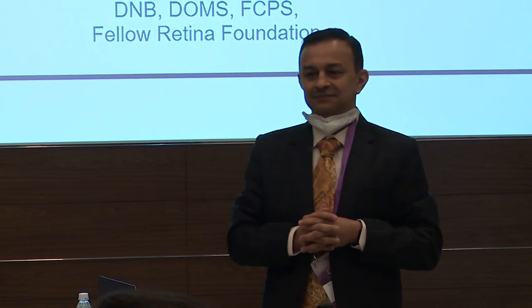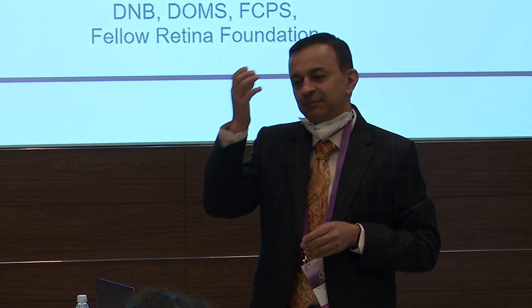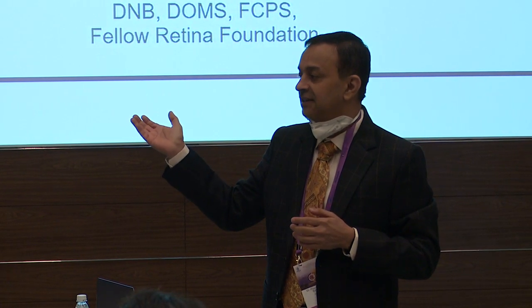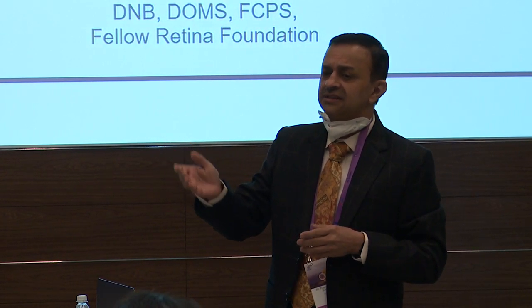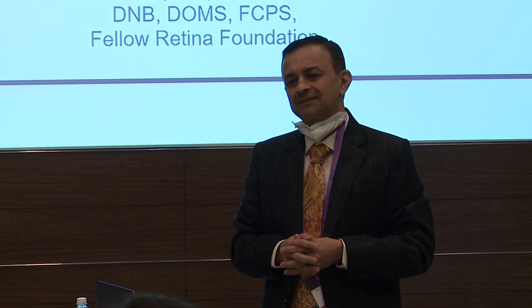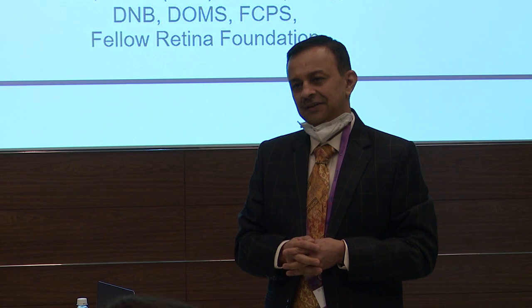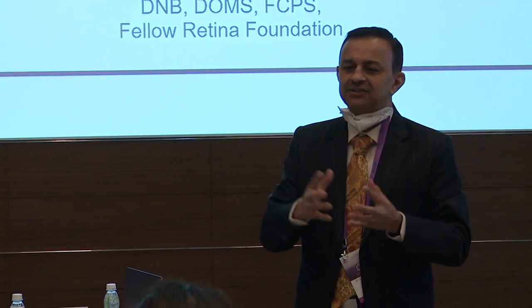Angiography is a dynamic process, right? It shows the leak. OCT will not show the leak, but you can really pick up beautiful images, like Nitin sir shared a few of his photographs. Many of these lesions show neovascularization even on OCT angio, but whether they are really active or not, you will know only by FFA. You can make out from the patterns, but yes, definitely, angio makes it more comfortable.